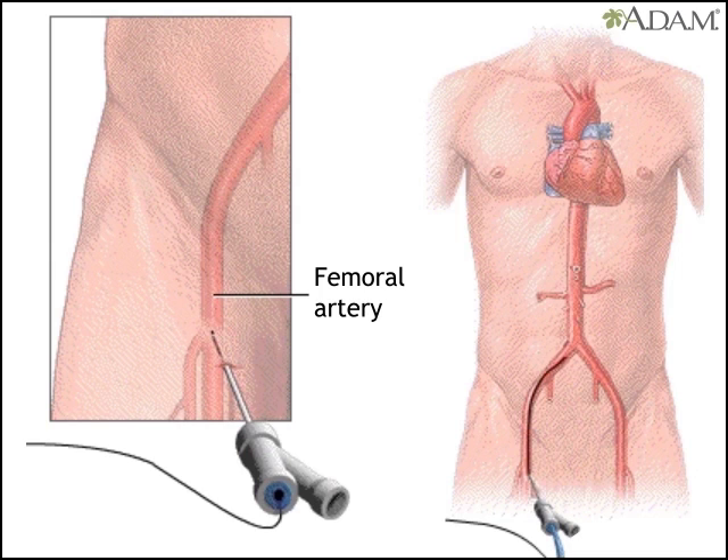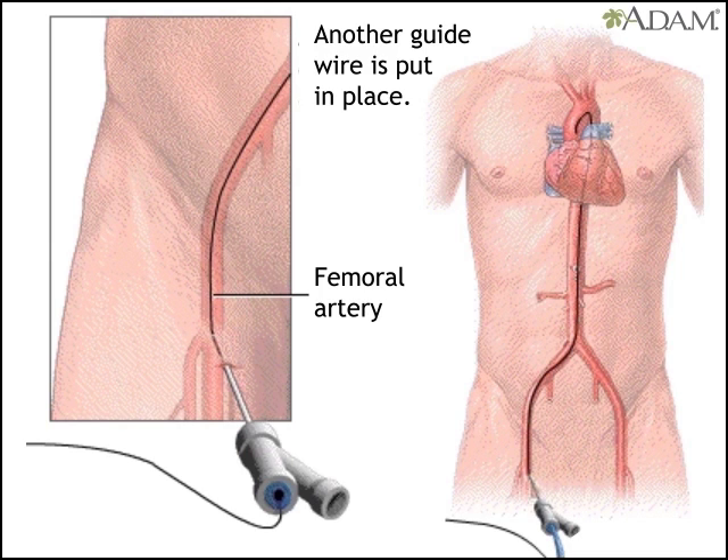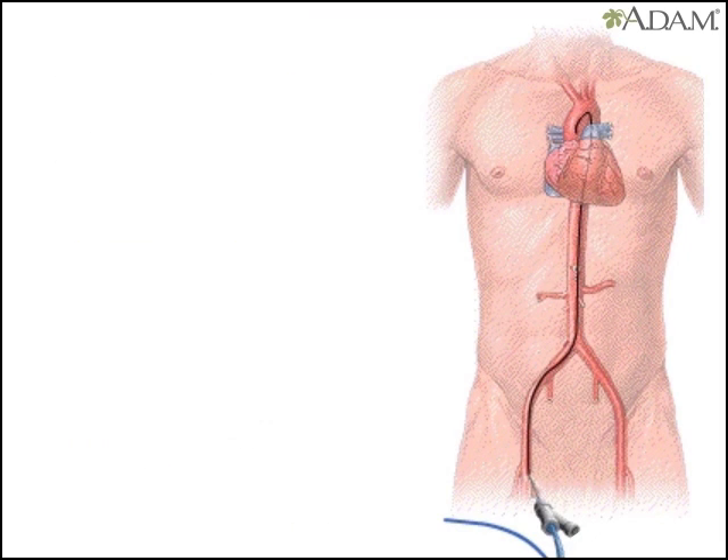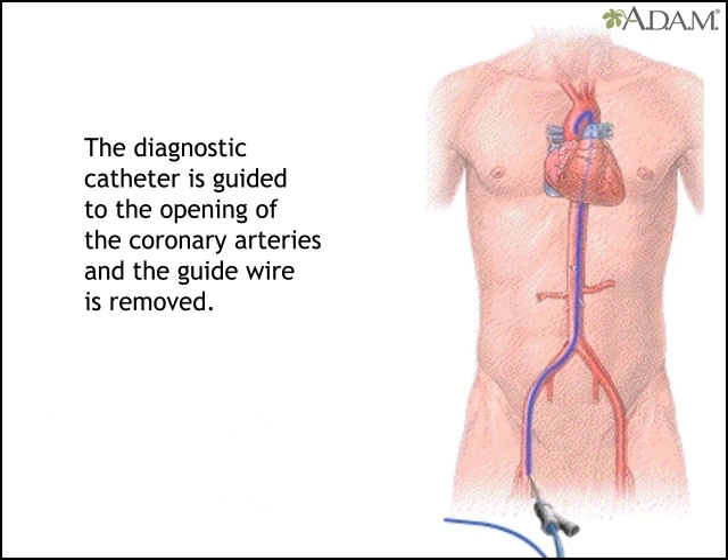Then the original guide wire is replaced by a thinner wire. The doctor passes a long, narrow tube called a diagnostic catheter over the new wire, through the introducer, and into the artery. Once it's in, the doctor guides it to the aorta and removes the guide wire.